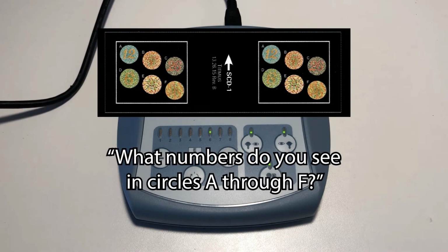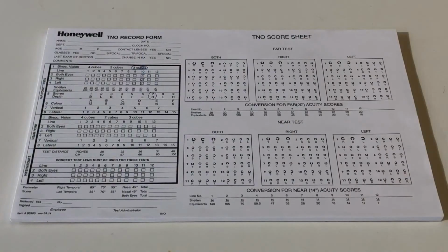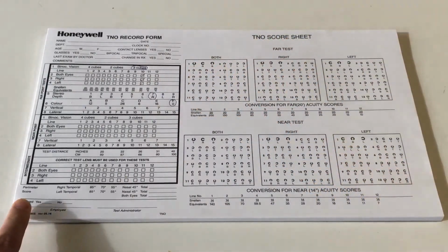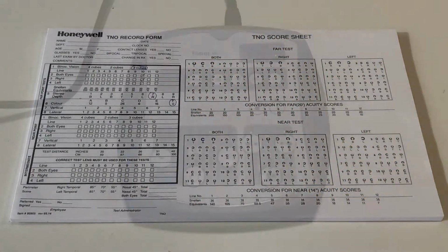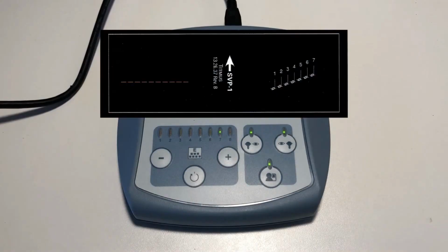Say to the patient, read me the numbers you see in circles A through F. Circle the last correct answer given on the record form. Note that circle F is unintelligible. Advance to slide number 7. This slide is testing for vertical phoria.